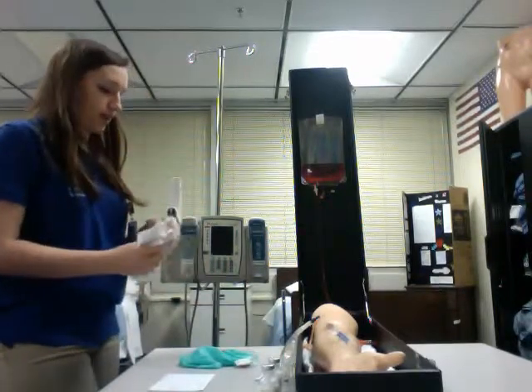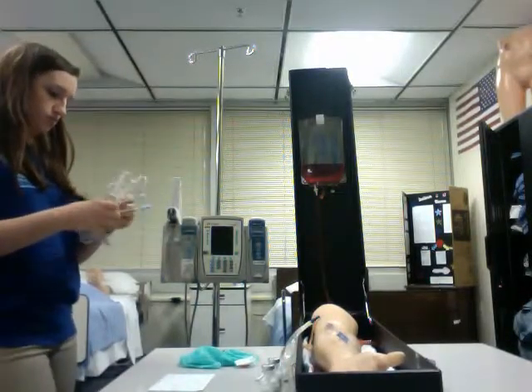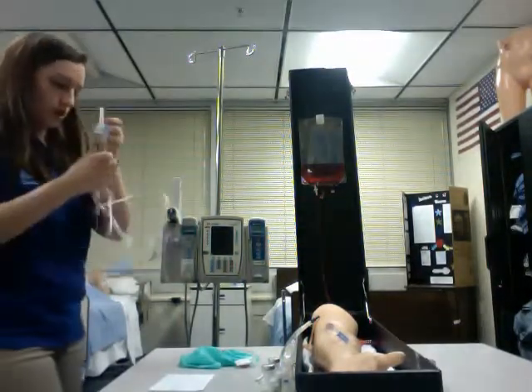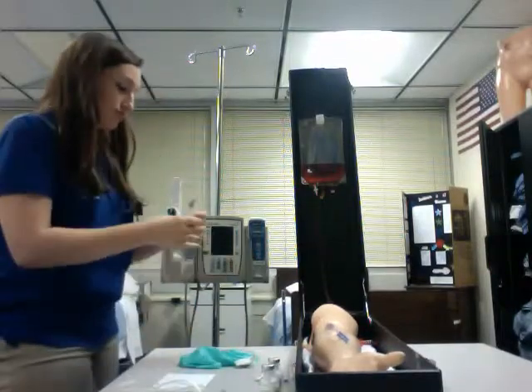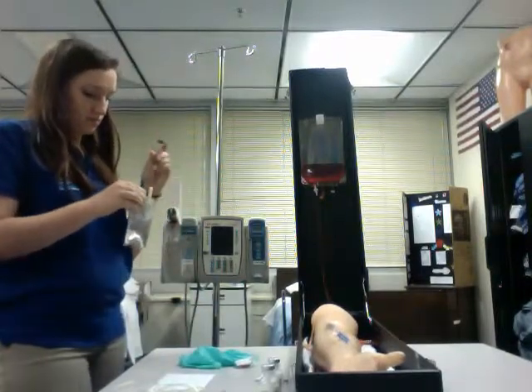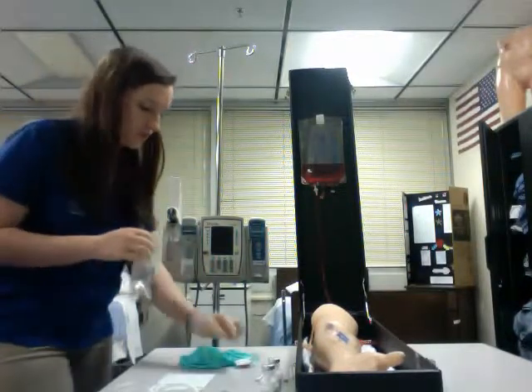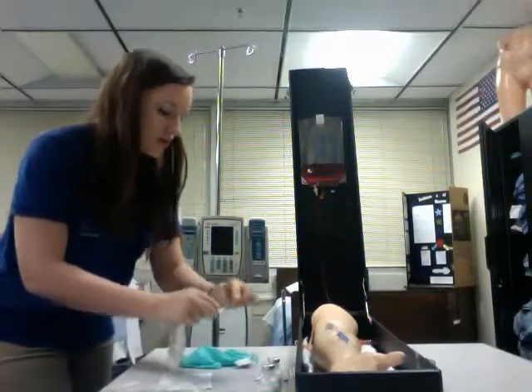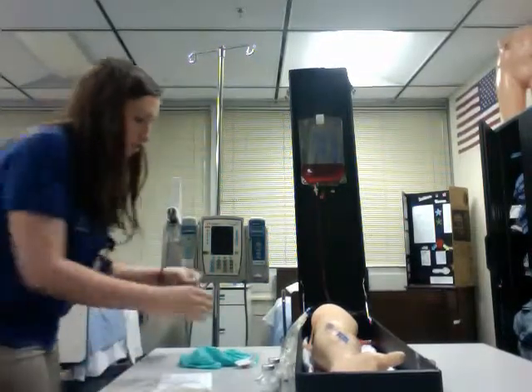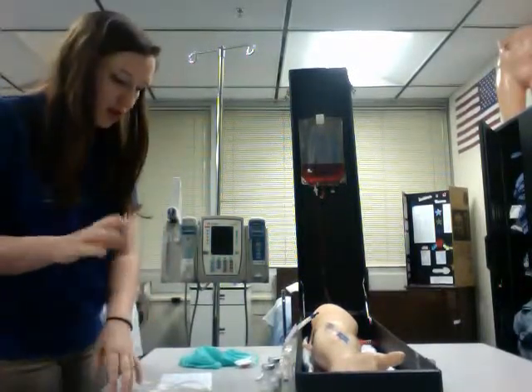First I'm going to prep my tubing. I'm going to mix my medication first. We'll do that first. Okay. So now that that's done, I'm going to go ahead and discard this in the sharps container. And I'm going to go ahead and stick my medication label on the bag. It's got the date, time, and my initials, as well as what medication is being given.